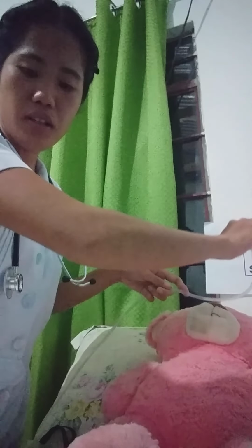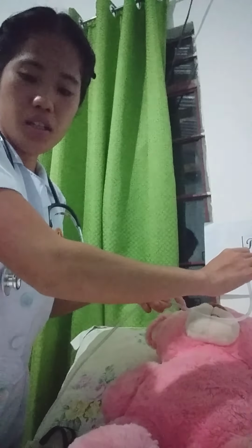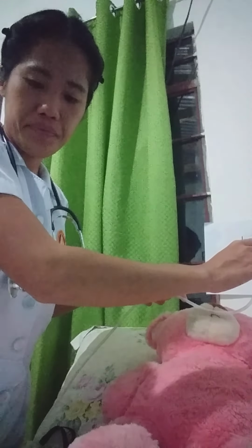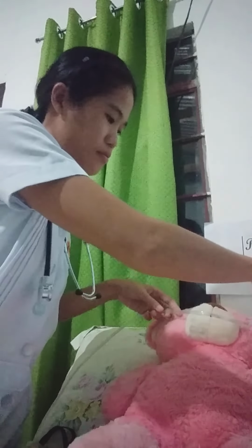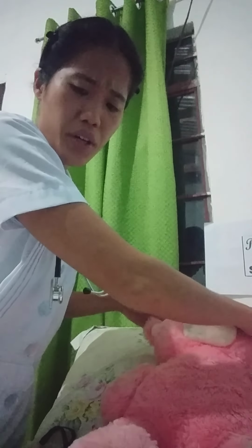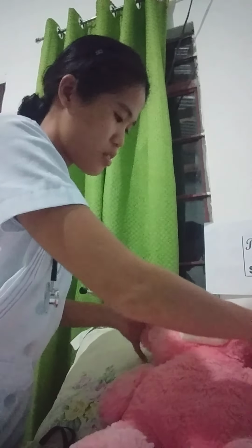And place the cannula prongs into the nares. And then we have to wrap the tubing over and behind the ears.